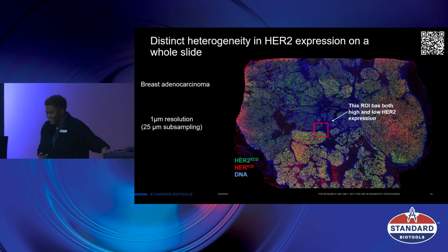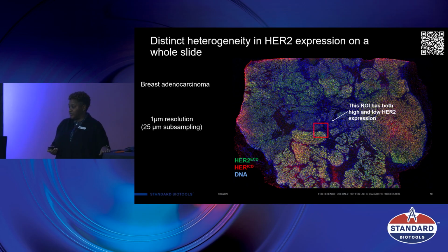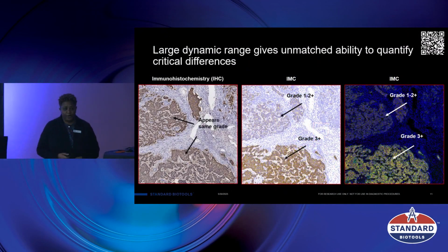So this just demonstrates the distribution of HER2 and how it's distinct in populations. If we look at this ROI and go a little bit further, this is where I was getting to with the IHC.